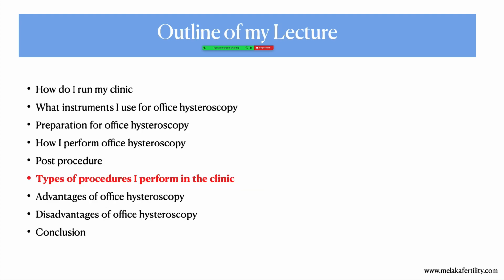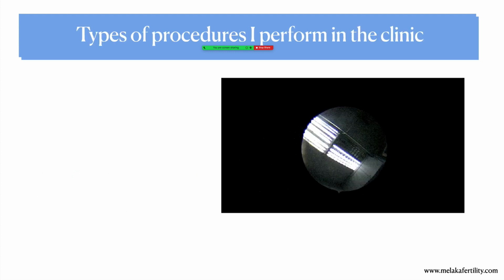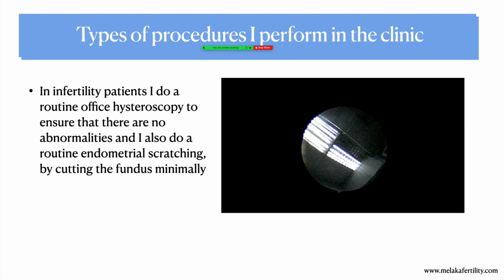So what are the types of procedures I perform in this clinic? There are many different procedures we do. First of all, of course, in infertility patients, I do a routine office hysteroscopy for all my patients.